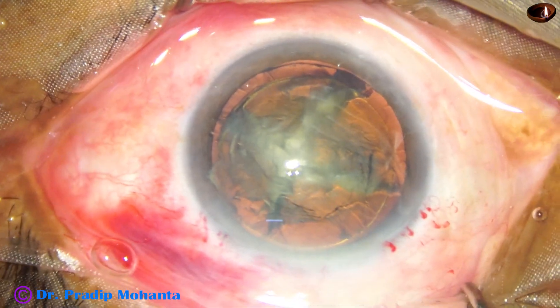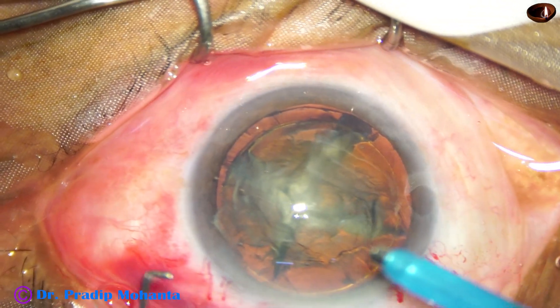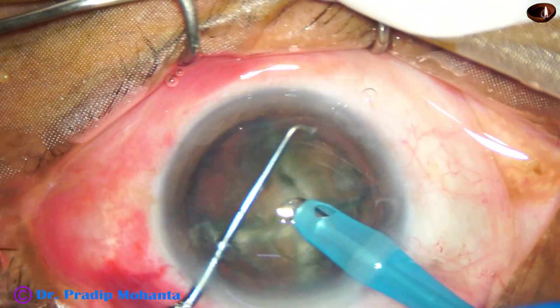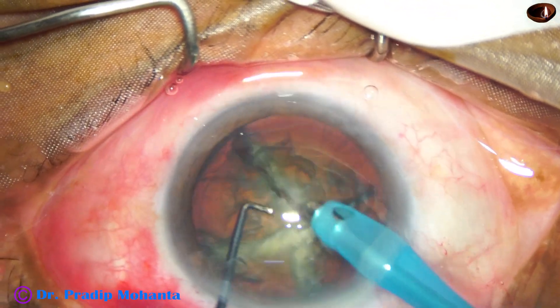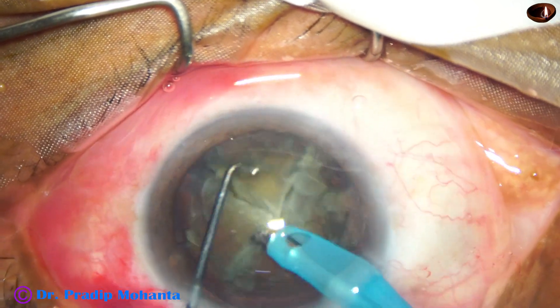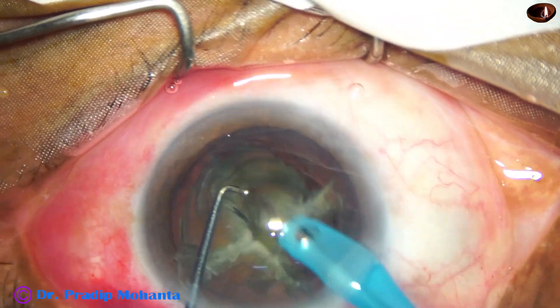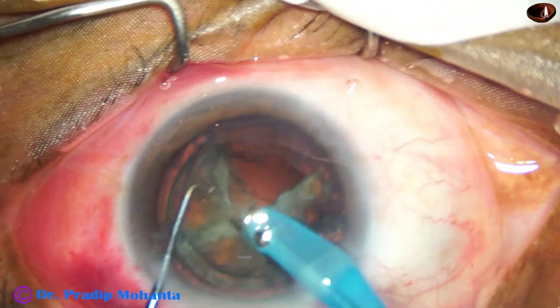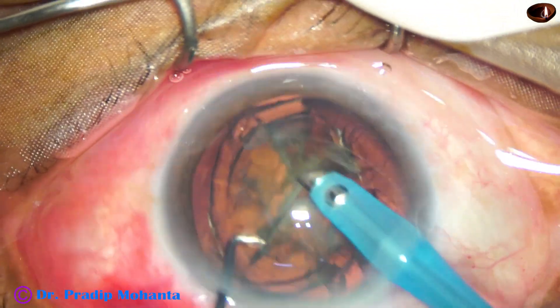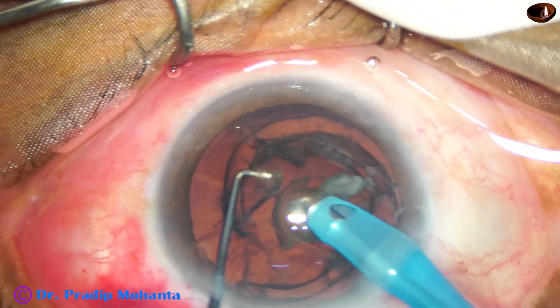If you try any other technique, you are going to spend more time with ultrasonic energy. Now it's just to go and pick up the pieces and emulsify. Ultrasonic energy is set at 60%, fluid flow rate is 45 ml per minute, and vacuum is 450 mmHg. The pieces are emulsified in this setting in a very short time, maybe in less than two minutes.